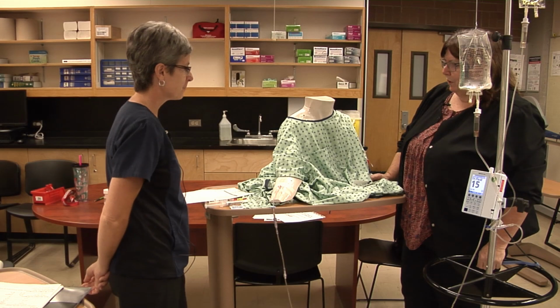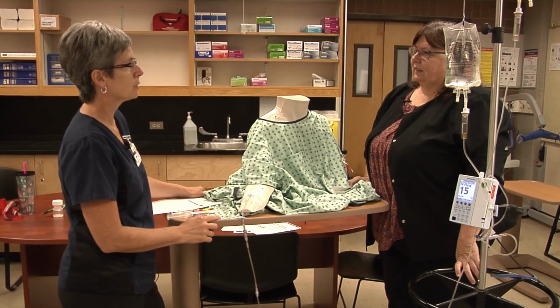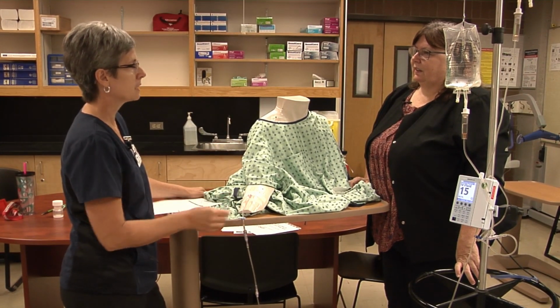Hi Renee. Hi Wendy. What are we up to today? So let's show students how to give an IV direct medication into a PVAD short that has an infusion going.